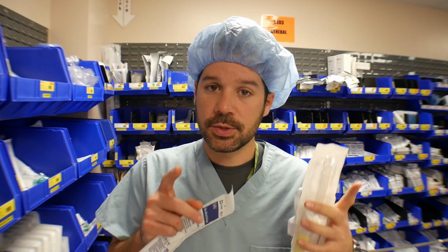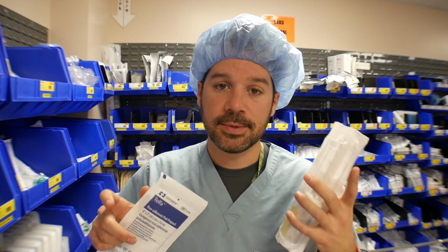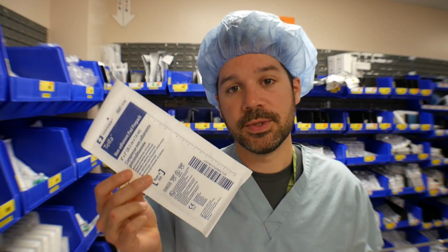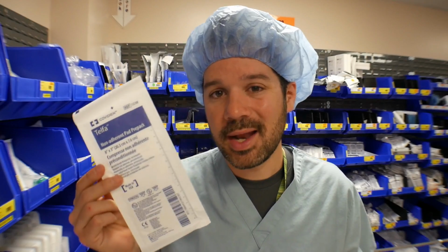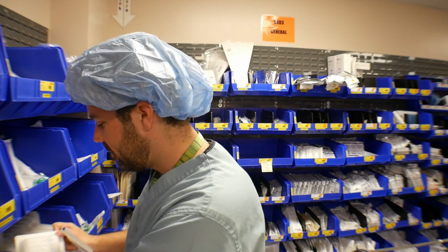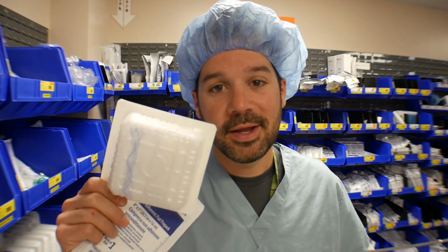A very important thing to note here is that when taking these biopsies on the field, you, the surgical tech, should have the available supplies for the biopsy. Number one for tissues, Telfa. It's basically just a non-adherent pad. You should never give somebody a Raytec to put a biopsy on and hand off of the field.